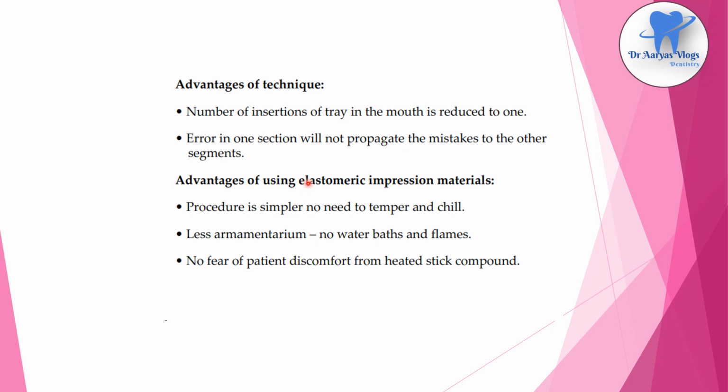And what are the advantages of using elastomeric impression materials? Procedure is somewhat simpler and no need to temper and chill. There is less armamentarium required, no water bath and flames, and no fear of patient discomfort from heated stick compound.